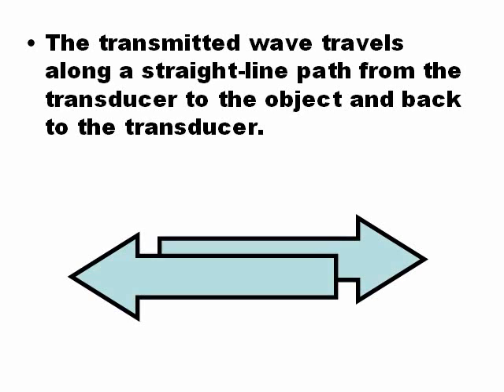The transmitted wave travels along a straight line. In other words, the ultrasound pulse goes straight and the ultrasound echo comes directly back to the transducer in a straight line. That is not always true, but it's an assumption that the machine takes to produce the pictures.